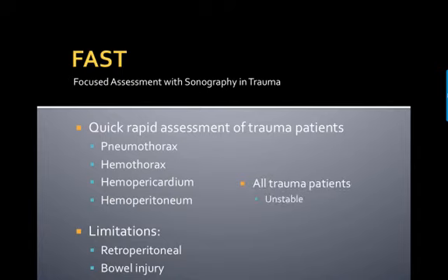Now, all trauma patients, whether stable or unstable, should receive a FAST exam. This way we can detect life-threatening injuries earlier and provide life-saving intervention faster.